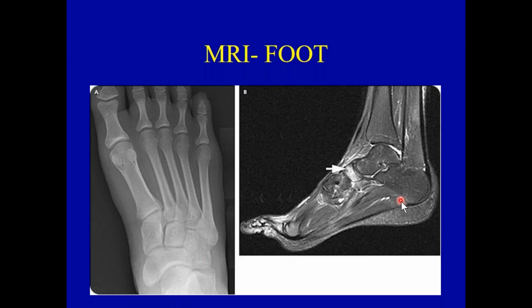So someone has to make a decision about at what point does it heal? So if the patient says, all right, I'm going to stop running for 4 to 6 weeks, if they do a follow-up MRI, this area that was white is now going to become black, and that's the radiographic sign of healing on the MR examination.